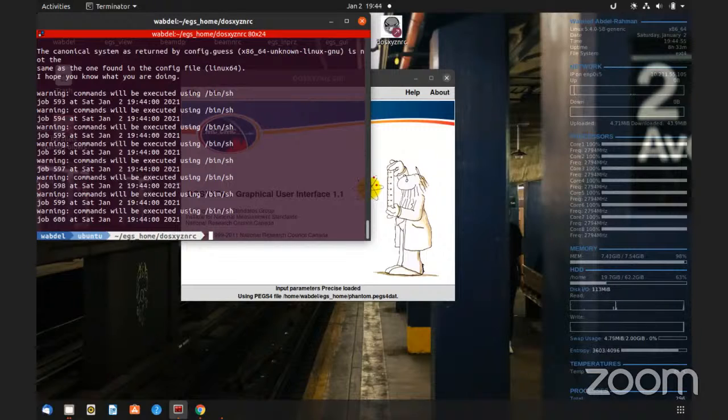Brachytherapy has to be done through EGS++, or you write your own code. These user codes that we're using, whether it's BEAM, XYZ, and so on, are ready-made codes. The geometries are fixed, and we can't modify that. So then you need to create your code, define your geometry, define these things. And with EGS++, I think that is doable because they do simplify things a lot.